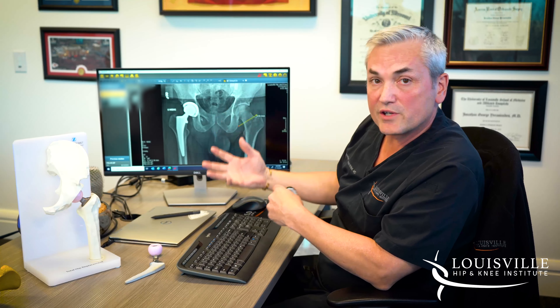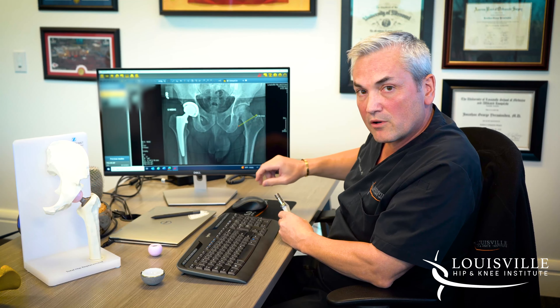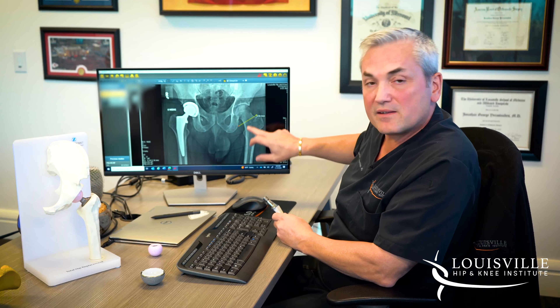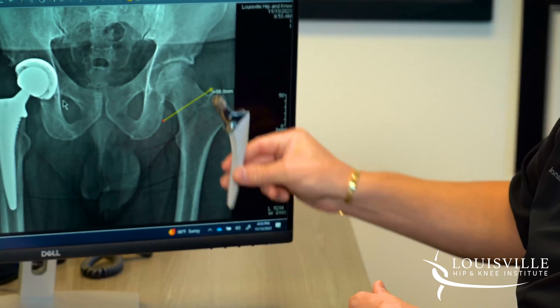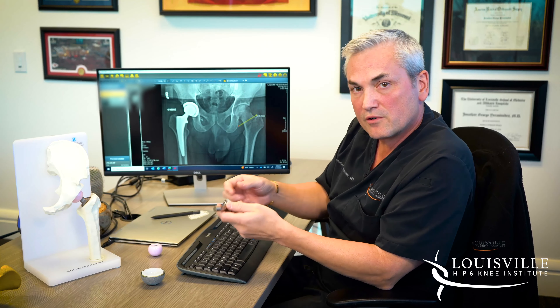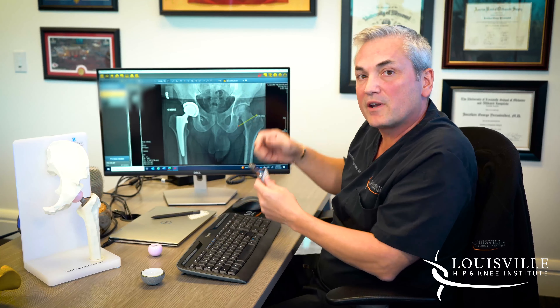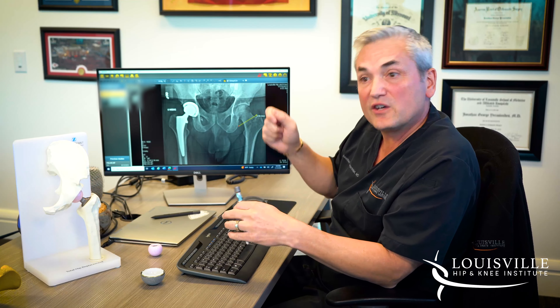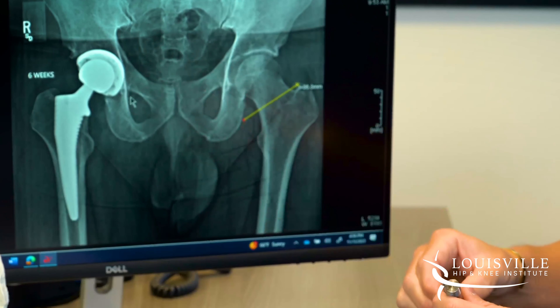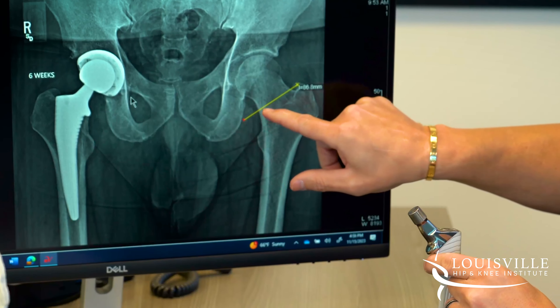Once the hip socket has been replaced, we have to replace the ball we just removed. We machine out the inside of the femur, which is made up of soft cancellous bone — the bone marrow. We start with a small broach, which is the same shape as the implant with teeth on it to remove bone as we tap it in and out. Once we reach the proper size and an x-ray confirms proper fill, we place the permanent implant down the middle of the bone, with the collar seating on our cut edge.